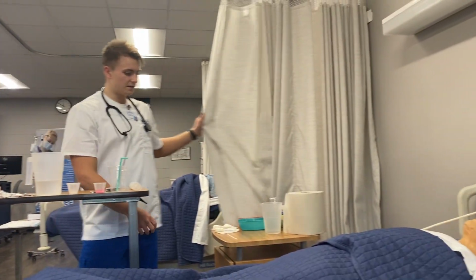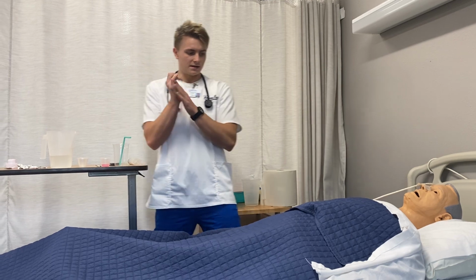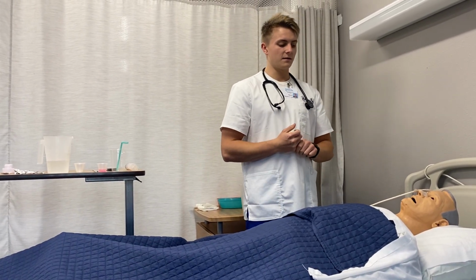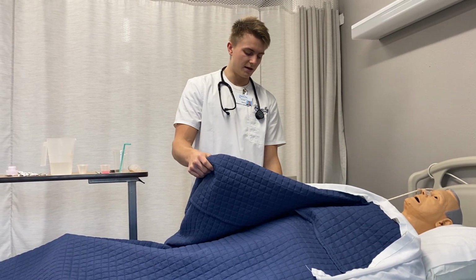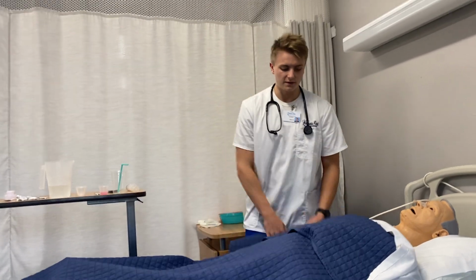I'm going to provide privacy. Hand sanitation. Introduce myself. My name is Cam. I'll be your nurse today. Can you give me your name? His name is Jim. And I'm going to check Jim's identification band. Ask Jim for his birthday, which he gives me, which checks out to make sure that we have 2 client identifiers.